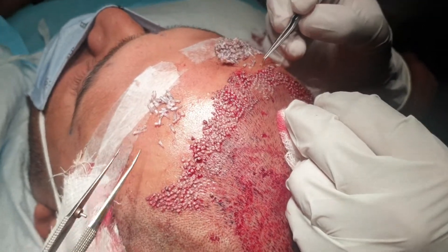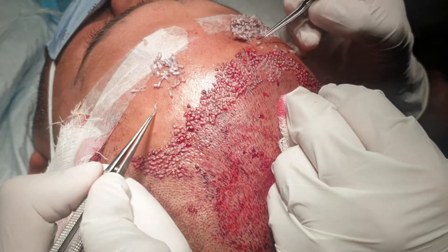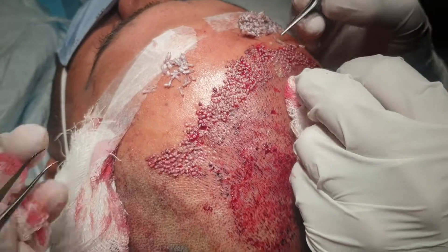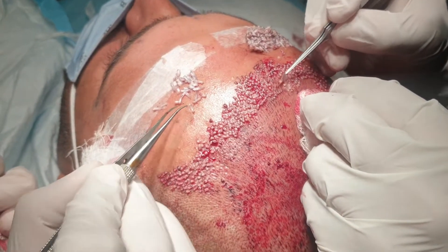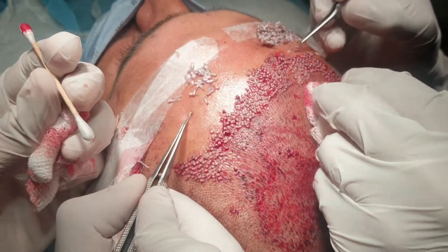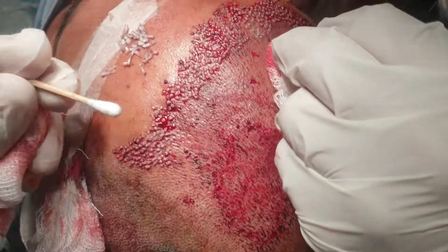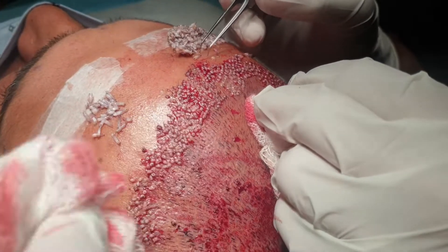A good hair transplant technician should be able to place 25 to 30 grafts per minute, or at a minimum of 20 per minute. That's the standard technique and standard timing. The frontal line is currently being done.